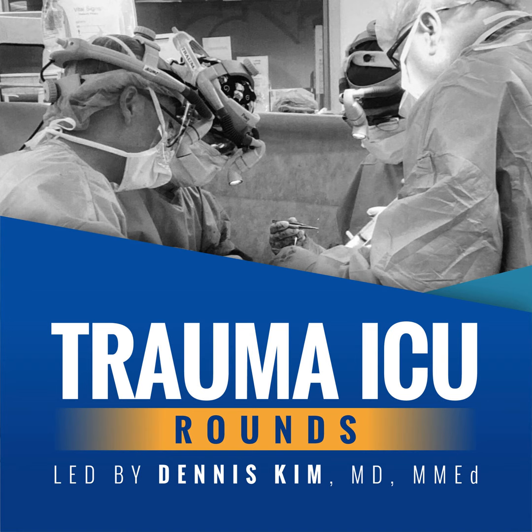The whole point of this conversation is just to say that if you've got a sick patient who needs to be on the ventilator, at least for the first 24, 48 hours while you're actively resuscitating and trying to augment oxygen delivery and reverse critical tissue hypoxia, just get them on full ventilatory support. As the patient gets better, that's when we can start to wean things off and then think about partial ventilatory support, with the goal, of course, of ultimately liberating our patient from the ventilator.